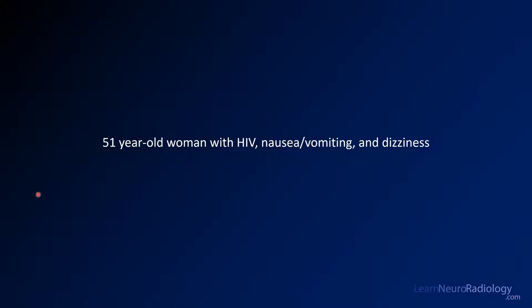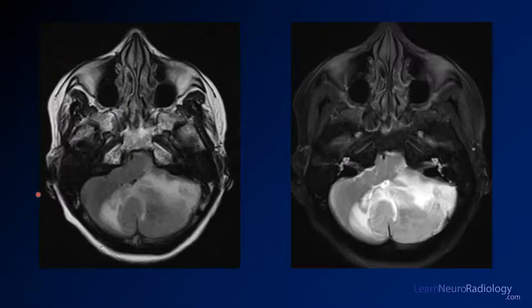We'll start with the case of a 51-year-old woman with HIV, nausea, vomiting, and dizziness. Here you have some MR images through the posterior fossa — a FLAIR on the left and a T2 on the right. You have this big expansile mass in the posterior fossa with a lot of surrounding edema and a lot of mass effect on the fourth ventricle, confirmed on T2.